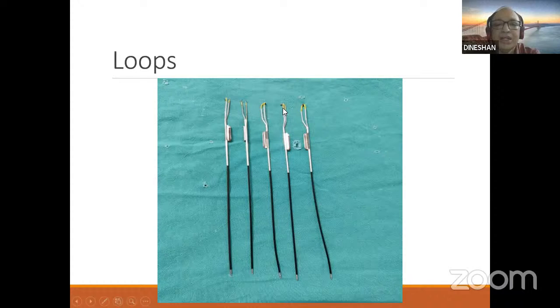And you have the Collins knife with which you can make an incision, especially for the TUIP, transurethral incision of the prostate. And this is the ball electrode, used when you have a large area you want to coagulate. Ball electrodes are always useful. Otherwise, if you want to do a point coagulation, either a loop or a Collins knife is enough.